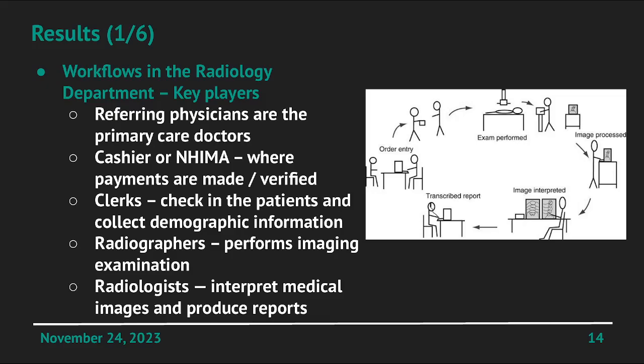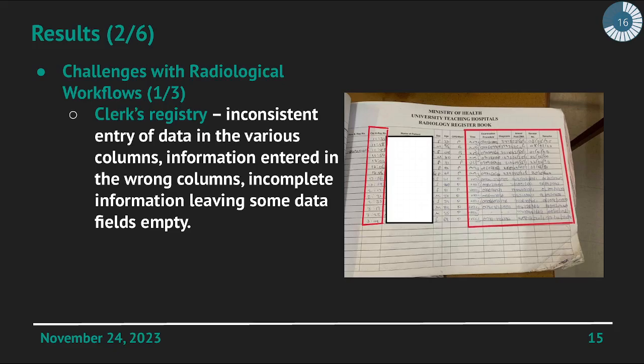There are radiographers that perform the medical imaging examinations and then produce results, which are sent to the radiologists, who interpret medical images and produce reports. To uncover the challenges with the radiological workflows, we discovered some inconsistencies at different levels among the different stakeholders.